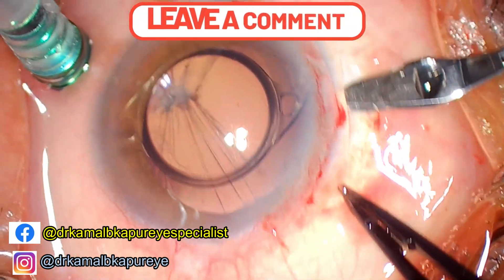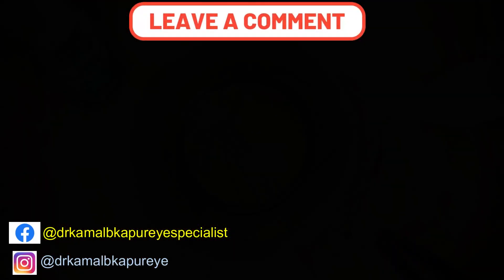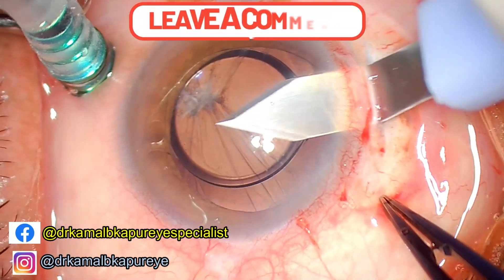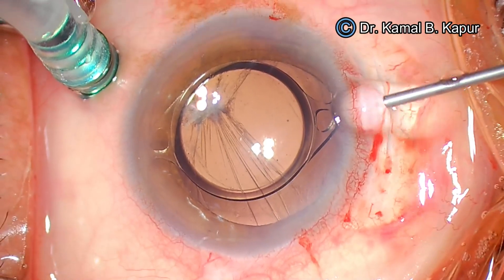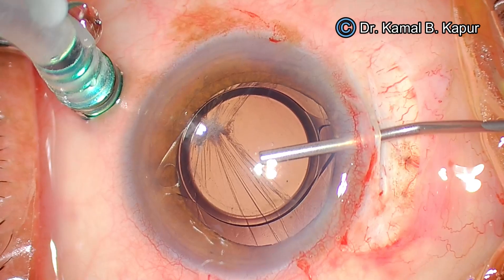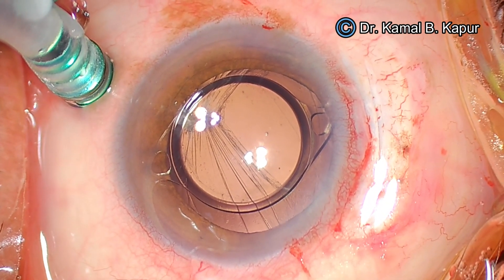While doing this we must ensure that globe rigidity is good to get a good plane. I ask the OT technician to increase the intraocular pressure by increasing the infusion to the scleral port. Once the incision has been made, we again reduce the pressure on the irrigation port. Now we've coated the endothelium.